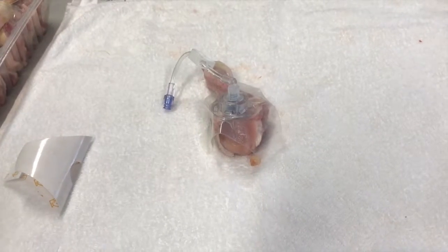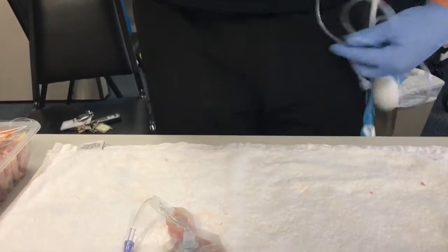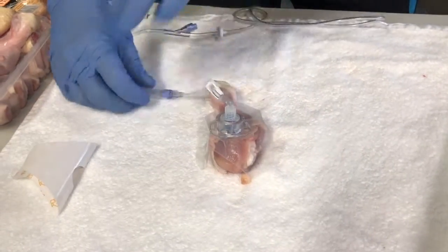Once that's done, I grab my bag of normal saline, which I've primed and placed in a pressure bag, and I attach it to the extension tubing, like so.